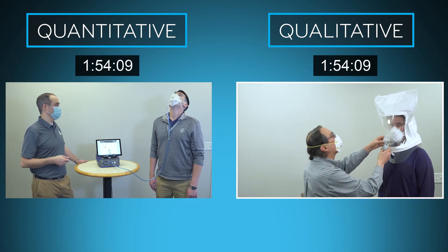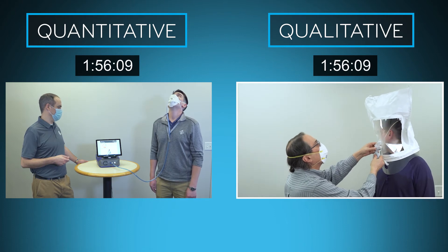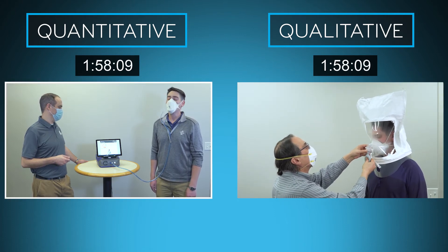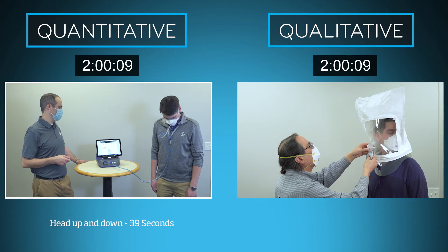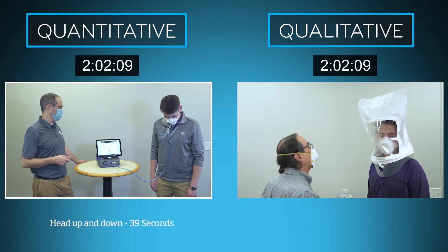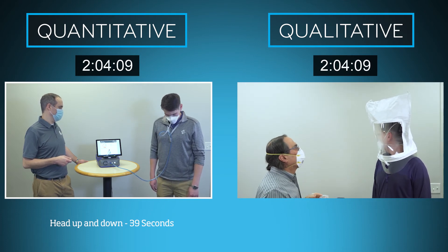With the qualitative fit test still completing exercise 2, the quantitative fit test moves on to the fourth and final exercise: 39 seconds of head up and down, with two breaths at each extreme.